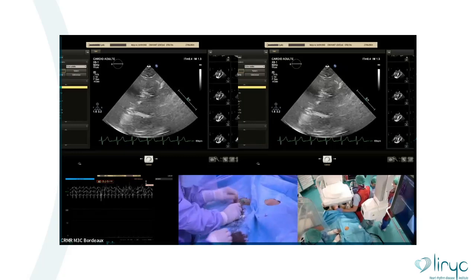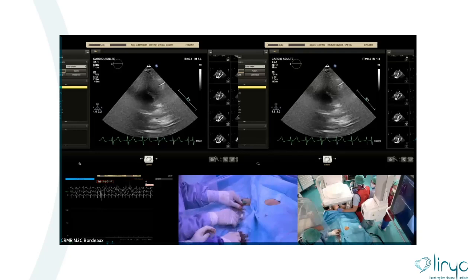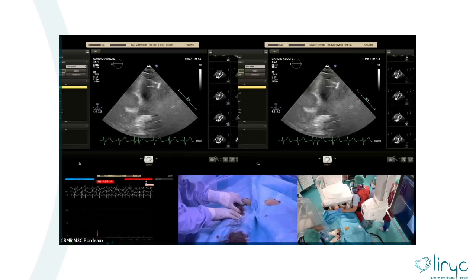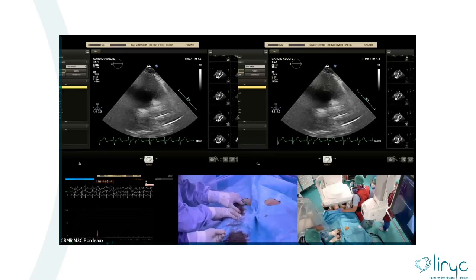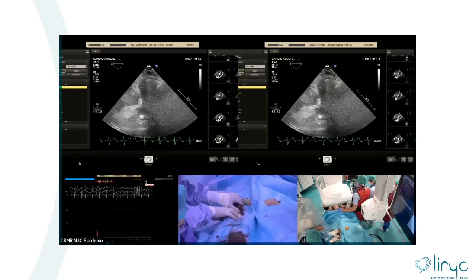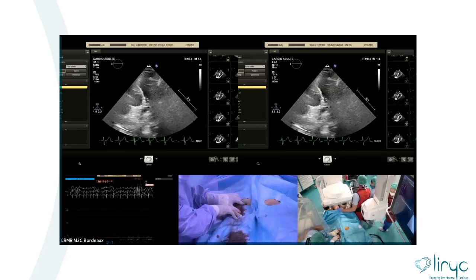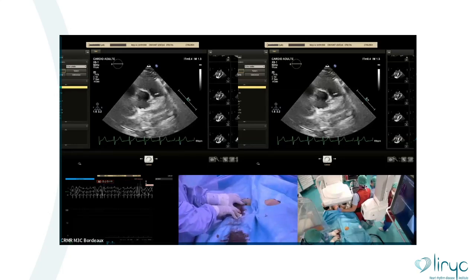So get the sheath out, can you measure it here with your hand? First we get the sheath out and put a marker on the sheath. When you put the marker, you measure 1, 2, 3, 4. Okay, it's here, 4. You also can measure from the other side. So it means that the marker should be here. Okay, good job.